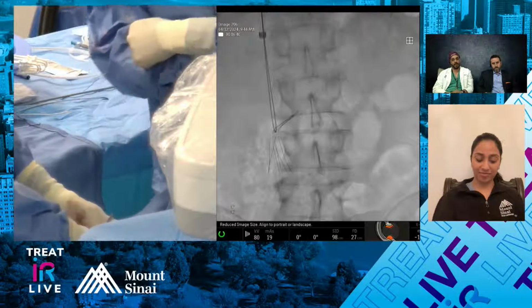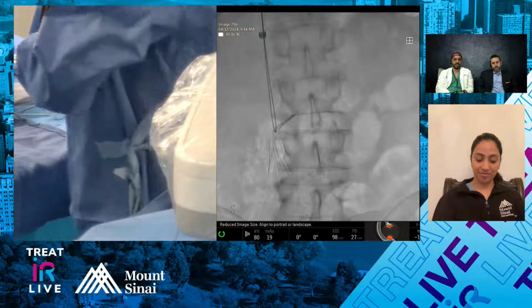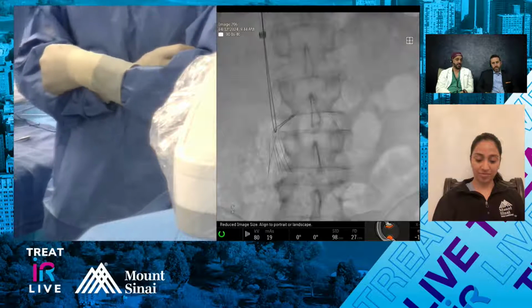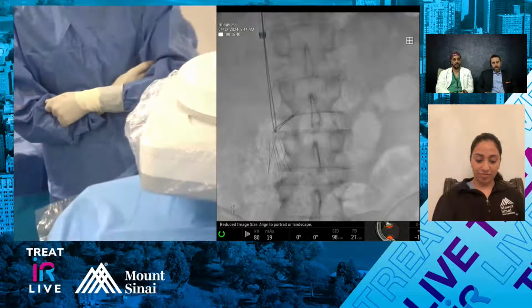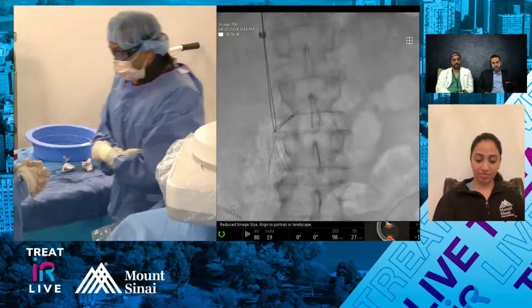You hope it flips the nose, the cone of the filter, to the right, and a lot of times it just tilts to the left, and it gets worse. So I think at this point you're stuck. You're going to have to go to forceps here, sort of give up the loop snare. Yeah, so I think that's what we're going to do.